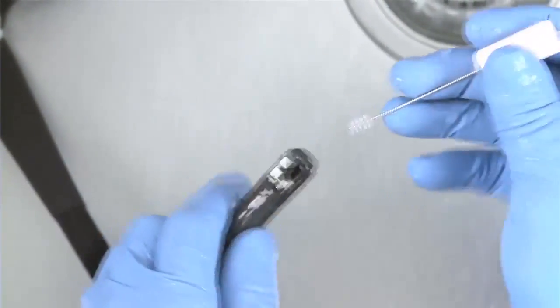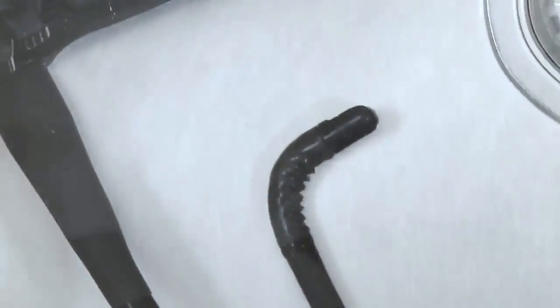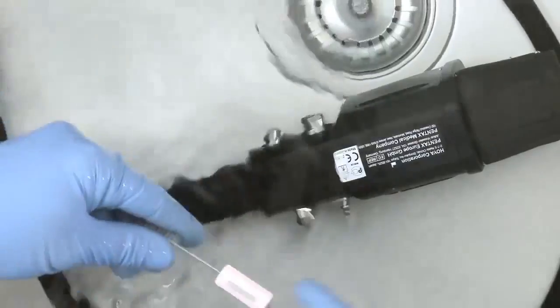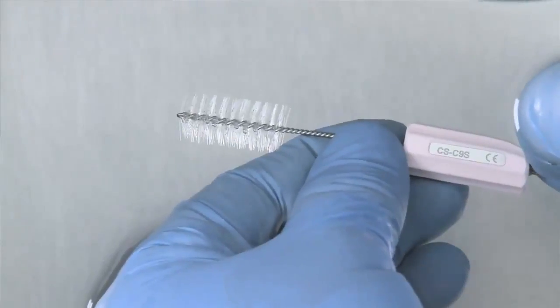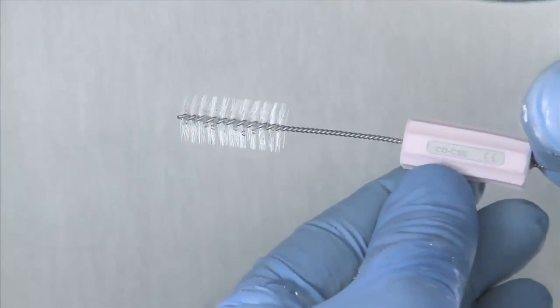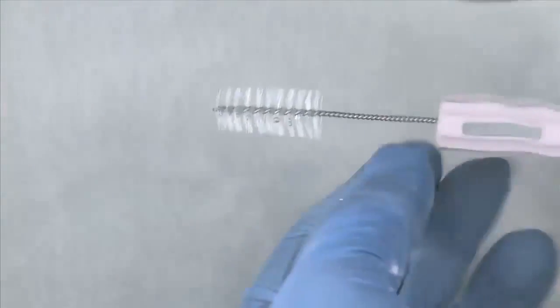When possible, make sure that the endoscope is kept completely below the fluid surface. Remember that this cleaning process is valid only if PENTAX cleaning brushes are utilized. Before attempting to use non-PENTAX cleaning brushes, please consult with your risk management department to ensure that the brush supplier has validated its endoscope cleaning procedure in accordance with relevant regulatory guidelines.